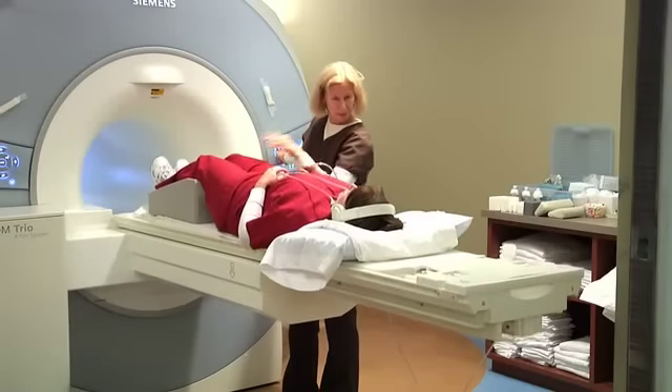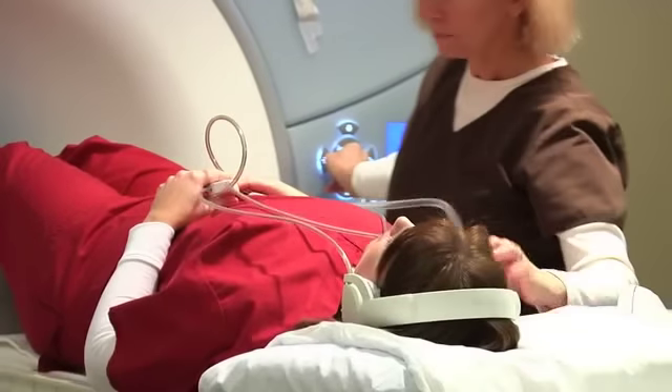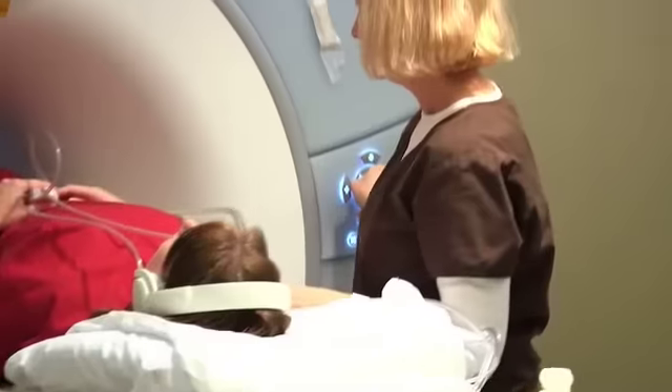In addition, we're going to give you a call button just in case you need to stop your scan. Once everything is set, the table will rise and your lumbar spine will be positioned in the center of the MRI scanner.